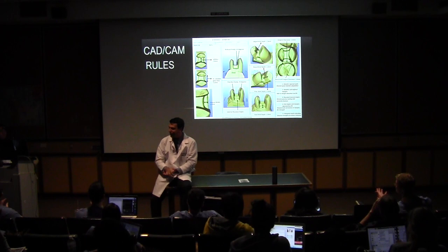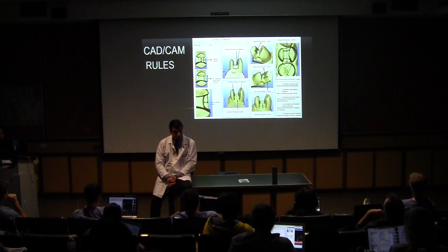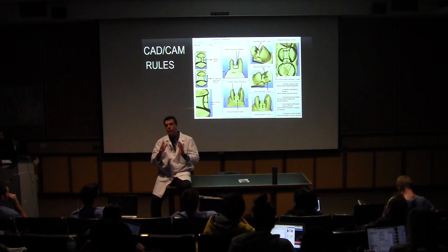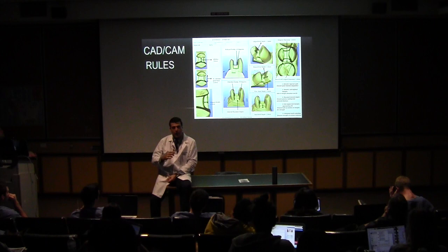We are going to the lab, and project number 11 is an onlay project where you don't have to drill the tooth. Because first, you don't have time. Secondly, I want you to concentrate and memorize those rules first, and also get a sense of how to work with the ceramic software. All right? So if you go on the e-curriculum, I'll actually show you here online.